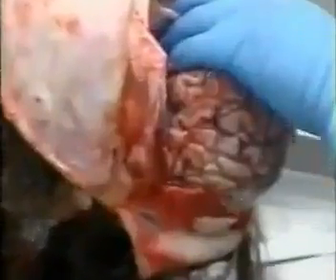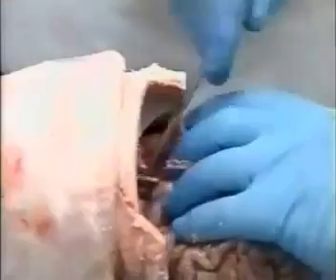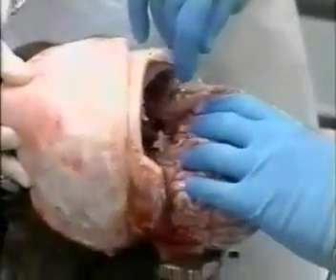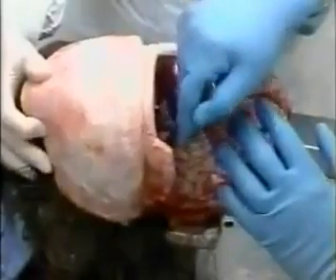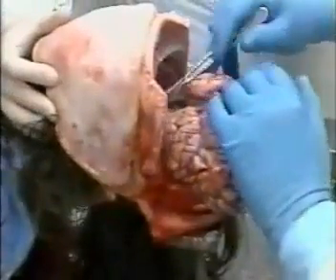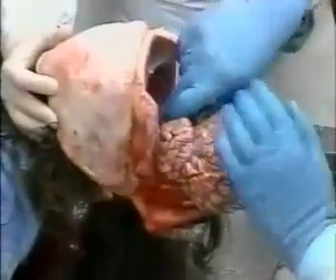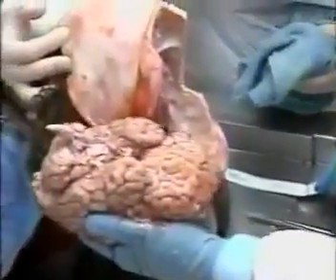First thing he'll do is reach down in and cut the optic nerves. They're the first thing holding the brain in place. Once those have been cut, he'll cut some of the other cranial nerves, and then he'll need to make an incision through the tentorium, which is a tough membrane that holds the cerebellum in the posterior fossa of the skull. Once that's done, he can put his knife down into the foramen magnum and transect the spinal column and essentially deliver the brain.